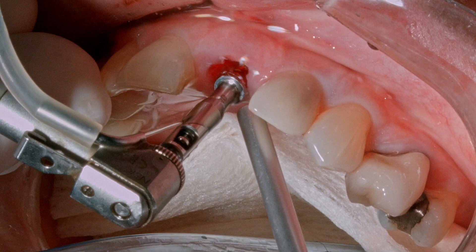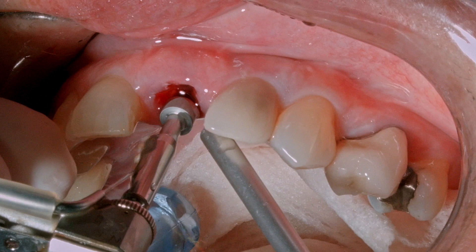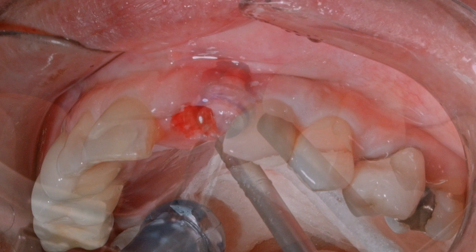Our first case is a maxillary central incisor immediate implant placement. We can see here going from the two millimeter twist drill to the number two multi-drill. We're drilling to place a 13 millimeter implant. The top of the black line is at 15 millimeters at the tissue level, so the implant will be appropriately countersunk.